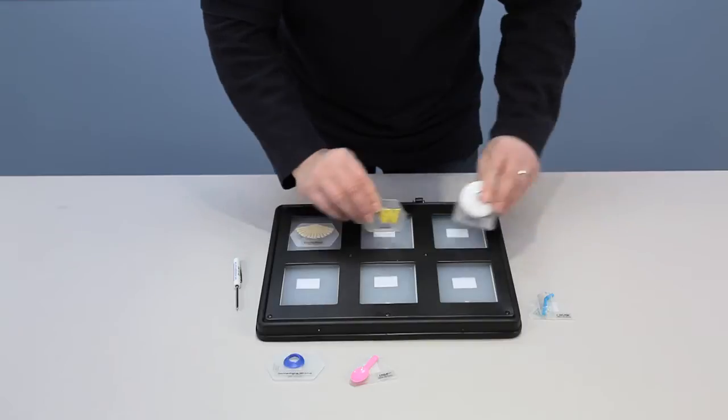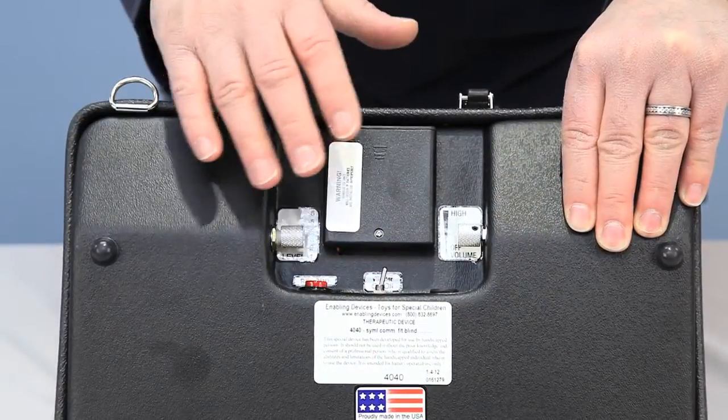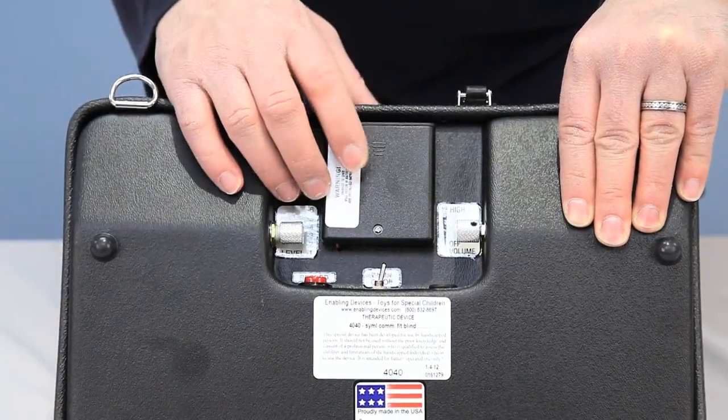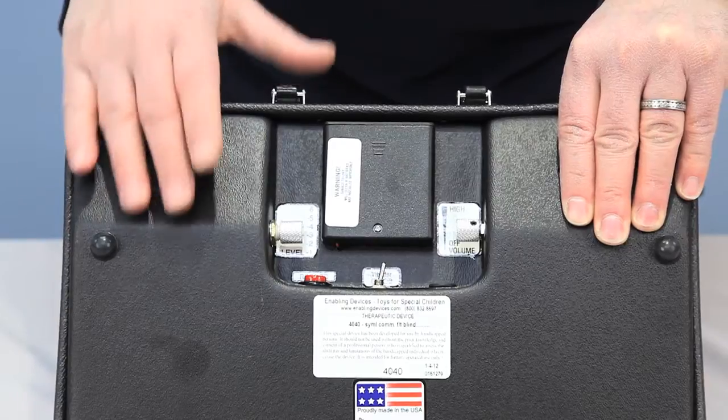The symbols are removable with a velcro system. This is the basic set of symbols that comes with the unit — they all just come off. On the back is your battery compartment and all your controls. It uses four double-A batteries.